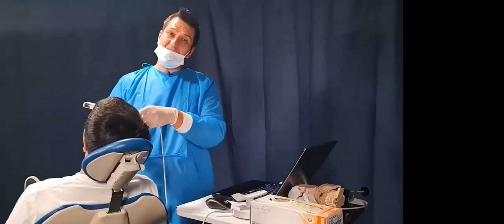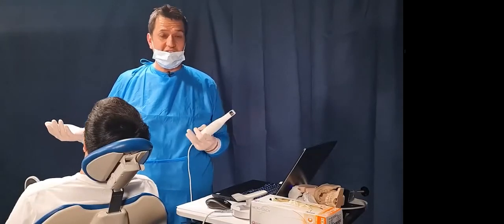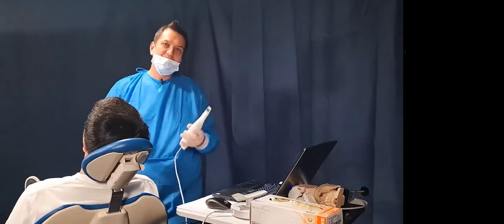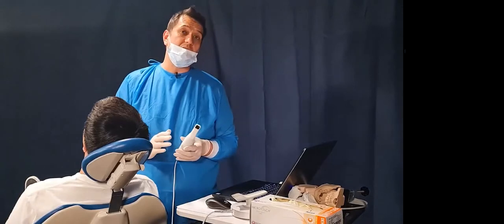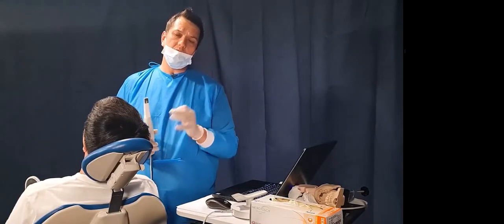And you notice that I had my hand position running across the patient. And this is how you know this is real life TV, right? If we were mucking around, it just gets it like that. Well, it's not always like that. And please don't beat yourself up about it, because it's quite difficult. It's actually quite difficult to do. So there is our hand position.